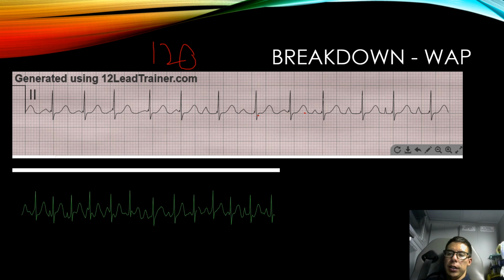Let's see the dynamic cardiology of that. Cool.